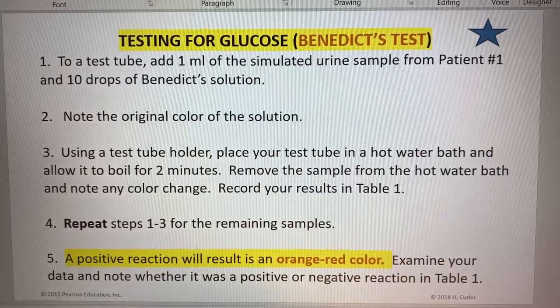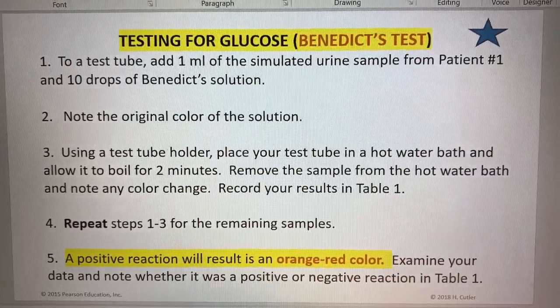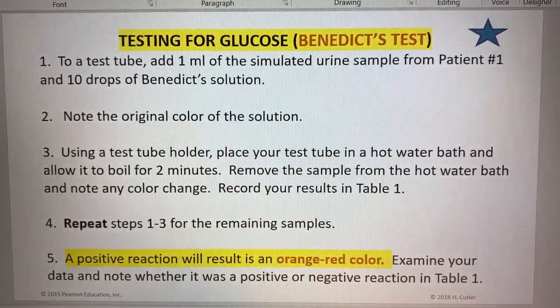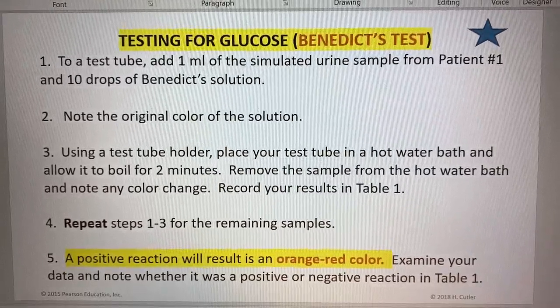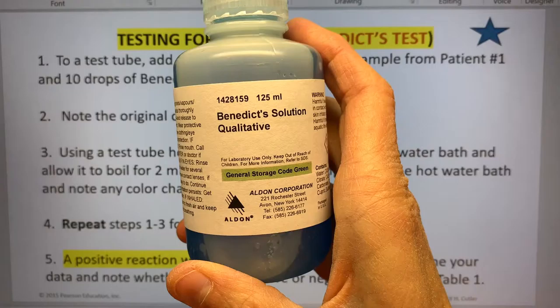Let's look for the presence of glucose or sugar in the urine. We'll know that's not normal, that's pathological. To test for glucose, we're going to use Benedict's solution.